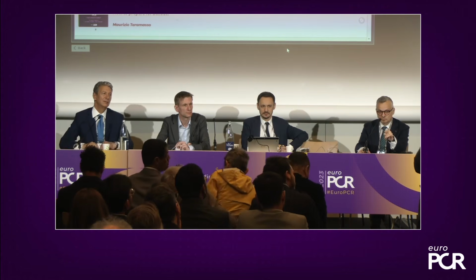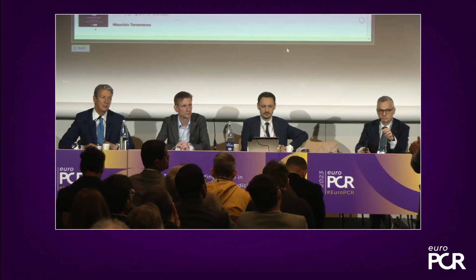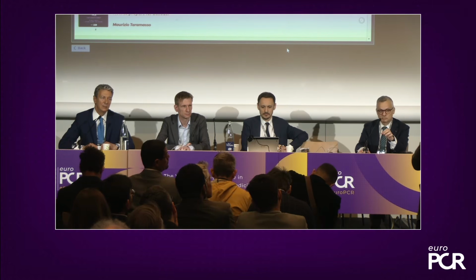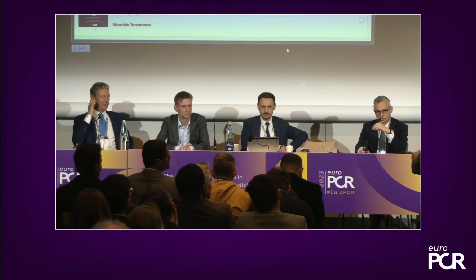Just a quick question and a quick comment. The first question is regarding the concern of the ProGlide being too deep. What I usually do is, once I have the foot up and I pull back, I look at the side arm, and if the bleeding stops, that makes me comfortable that I'm against the wall. But if it continues to bleed, then I'm concerned I'm too deep. Does that make sense? It's a good point, sure.